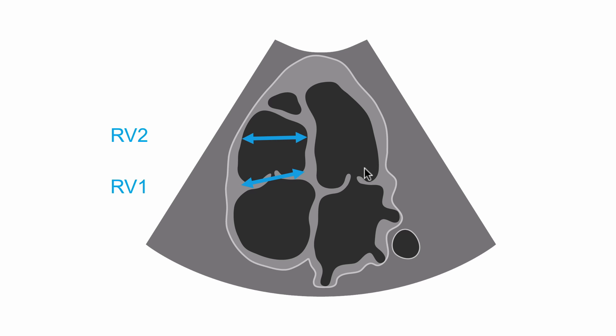We'll measure RV2 in the mid cavity of the right ventricle and we'd expect this to be less than 3.5 centimetres. Then we'll go on to measure RV3, which measures from the apex to the plane of the tricuspid annulus, and we would expect this to be less than 8.6 centimetres. We don't use gender-specific normal ranges, but we do have different normal ranges for adult and paediatric practice.